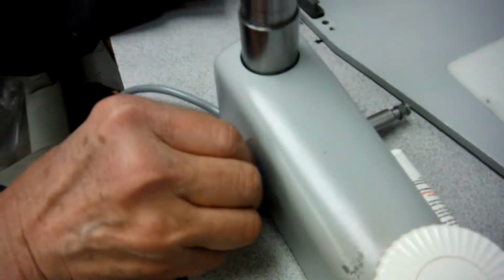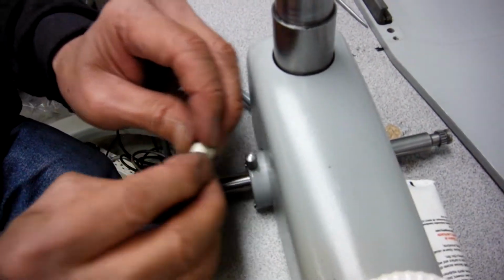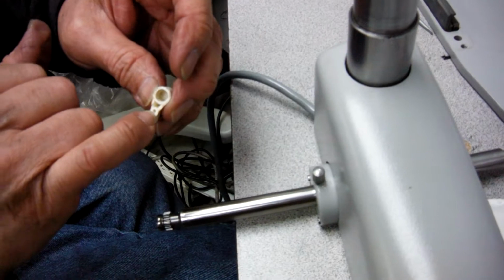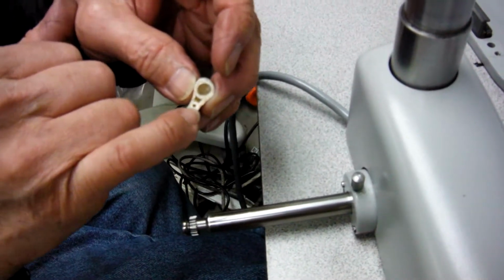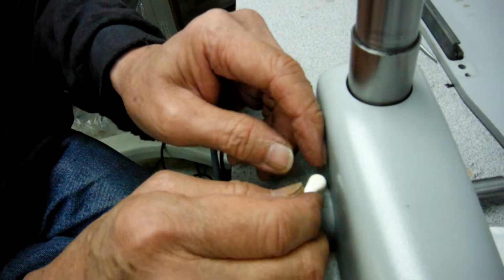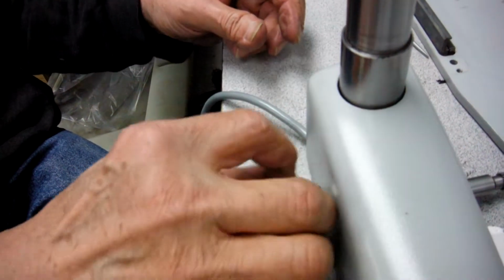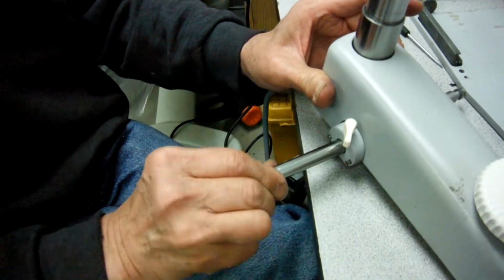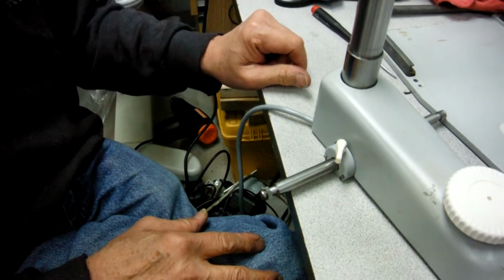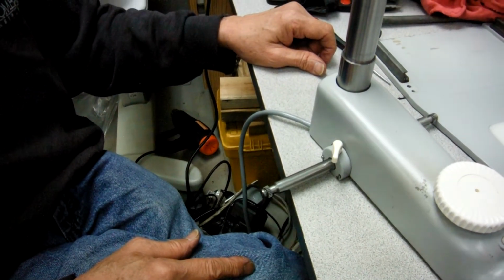And the lock knob, you use your hand, tighten it as much as you can, and it's not going anywhere. Some of these are already broken, but actually they have a little nipple out here to stop it from running all the way in. This one doesn't have it, so you can put it like that, and that's for the lock. Bring it back, lock. Okay. That's just about it for taking apart the base of the Zeiss 100/16.